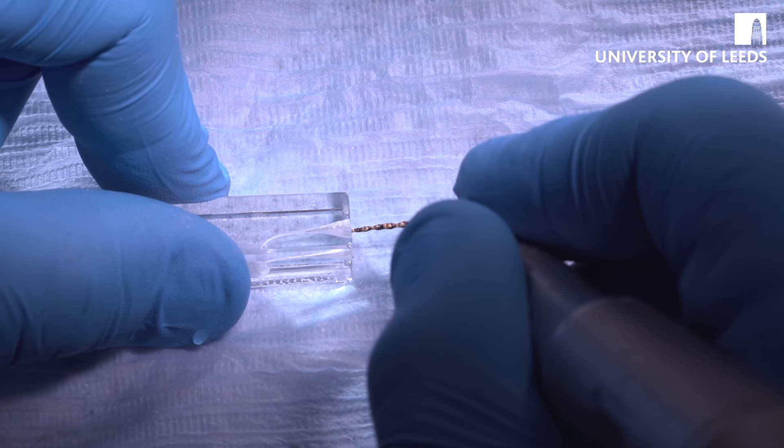Now unlike with the ProTaper Gold where we're looking to see this two millimeters or so away from the working length, you're not going to get that here because this is a much bigger file. So what we're going to do is we're just going to insert the file into the canal, let it engage passively, and then just gently brush out. You can feel it just slow down as it goes in, as the file touches the canal. Just let it engage and then push it out. It's described in the literature as a pecking motion, but it isn't - you're just putting it in passively, letting it engage, and as soon as you feel pressure and the file being grabbed in the canal, you're just brushing out again. It's important only to do three passes with the file because the flutes get loaded with debris, and once that happens they can't cut anymore. So three passes, irrigate, patency file.